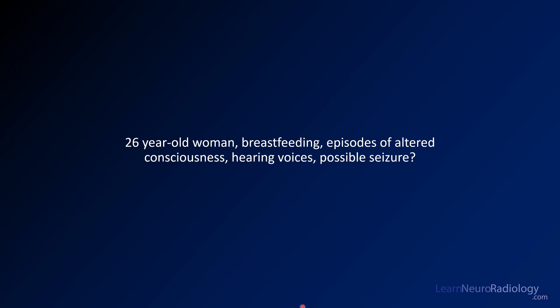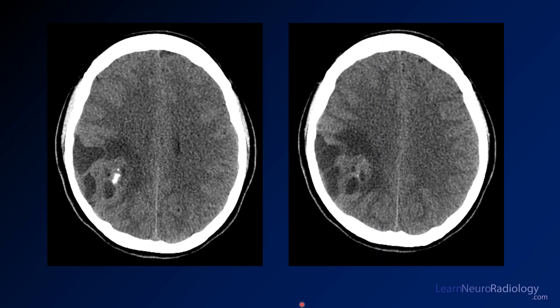Finally, we have a 26-year-old woman who just had a child and is now having altered consciousness and possibly seizures. On CT, there's a mass in the right cerebral hemisphere with a lot of surrounding edema, some central calcification, and a relatively solid-looking component. The margins are pretty well-defined with a little bit of mass effect, but it's not dramatic.